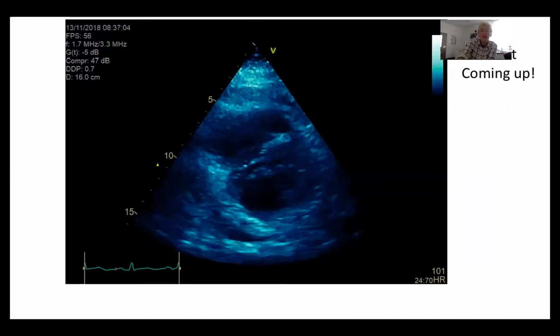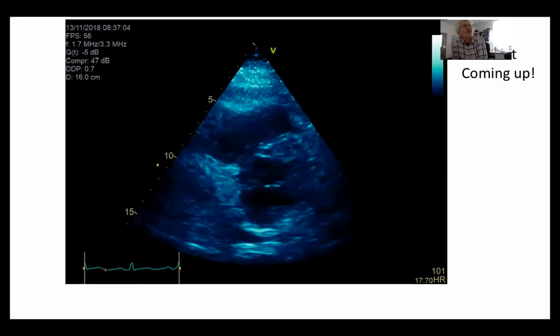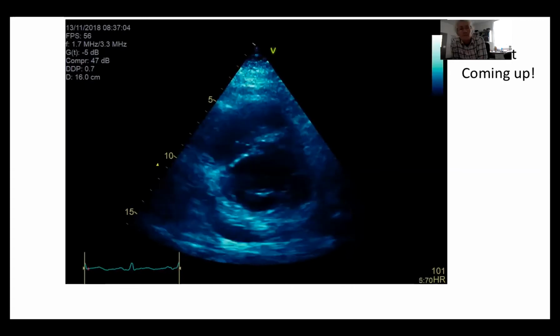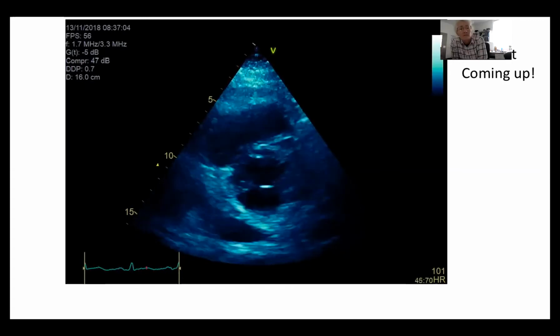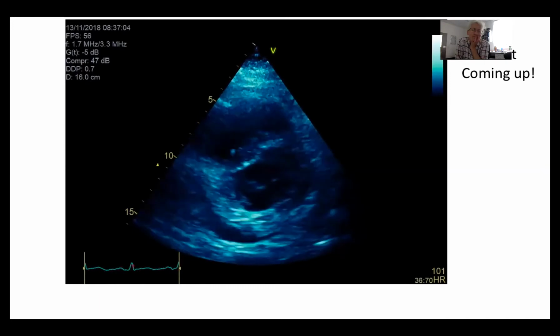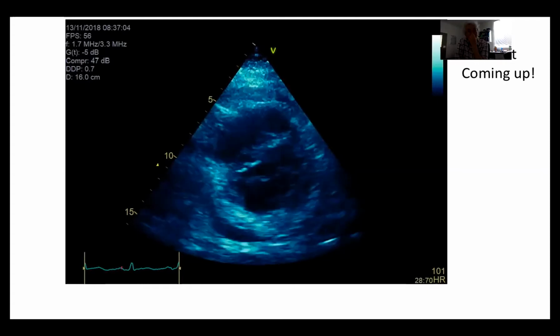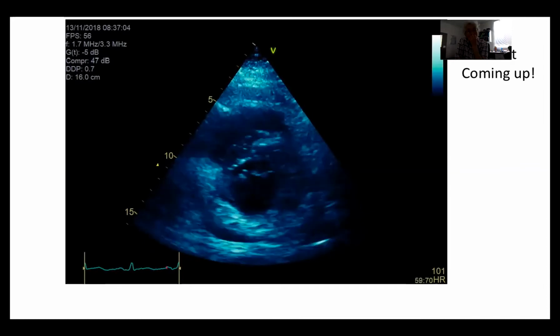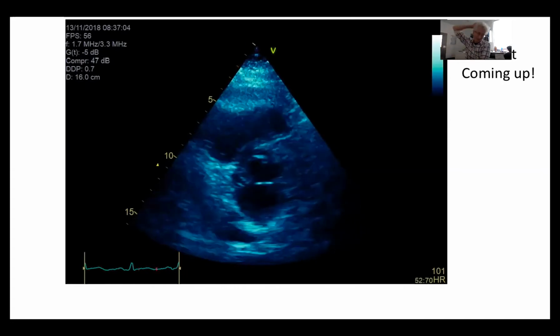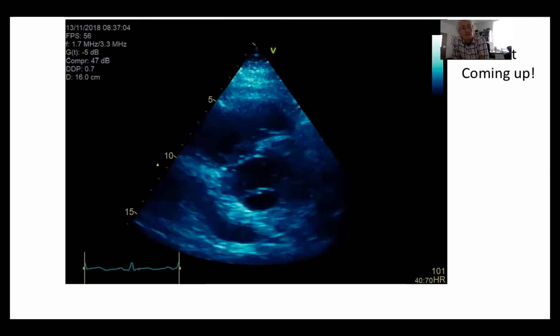Okay, I just want to show you, working through it pretty much the same way that you do your usual standard views. What do you think of this parasternal short axis? Okay, so this is a parasternal short axis at the level of the mitral valve. I think the LV systolic function is pretty normal with no regionals. The RV free wall, I can see it sort of trampolining, which suggests that the pericardial effusion is causing some pressure impingement or collapse of the RV. What do you think about the septum? Actually, the septum looks flat. I think the septum's also moving.